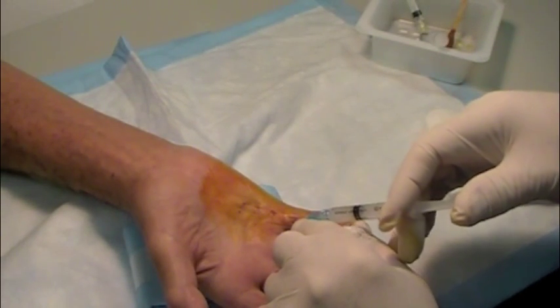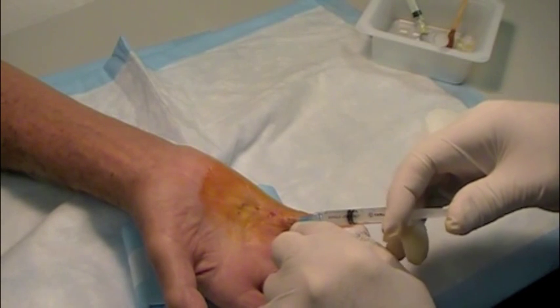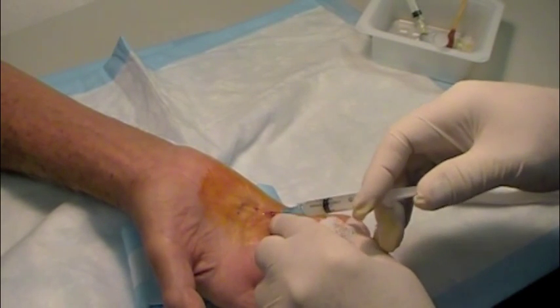A steroid is injected along the release sites in order to help decrease pain, swelling, and the recurrence of Dupuytren's.